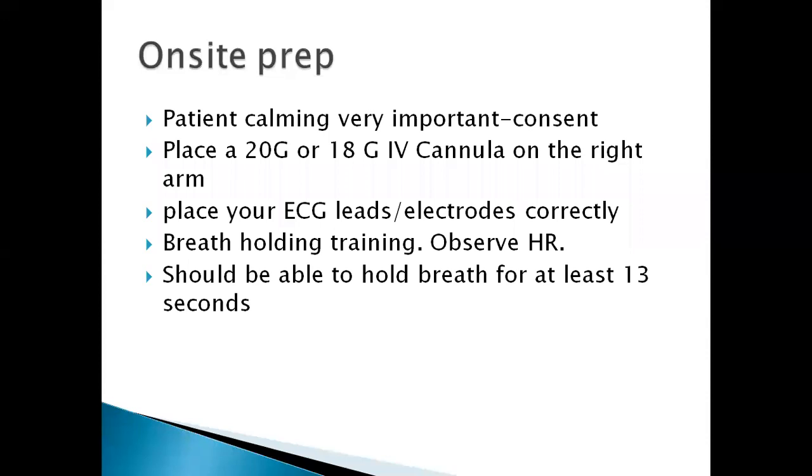And when the patient comes to the department on the actual day, make sure that the patient is very calm. This is very important. When the patient is calm, the examination moves so smoothly and the heart rate is steady. There's just a smooth flow of events. So just make sure you talk to the patient. Again, explain the procedure to them that you explained when you were booking. Make sure you get your consent and place your cannula now on the right arm.